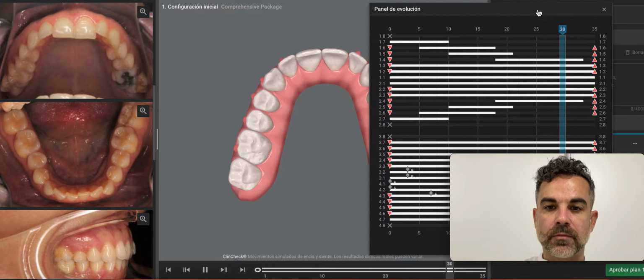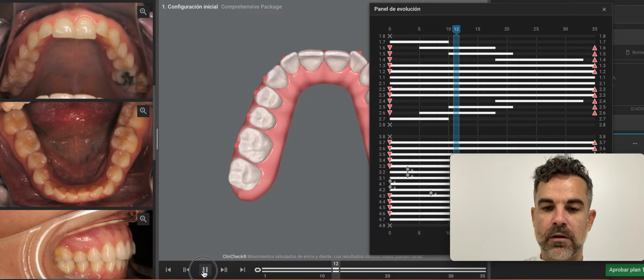So we know this is highly predictable because at these stages there is a simultaneous movement in both of them. So as you can see, we're having a movement of both, of 26 and 27 from aligner number 6 to aligner number 10, and the second stage of compression of the second molar. So this is really favorable from a biomechanical perspective. Compression of one segment associated to expansion of the other. Compression, expansion, compression, and expansion.